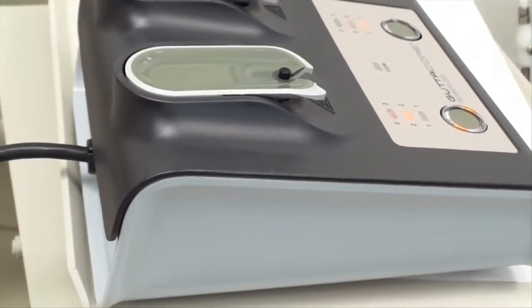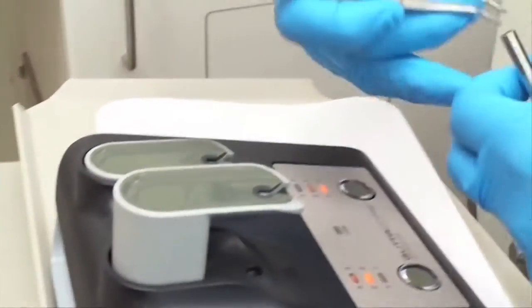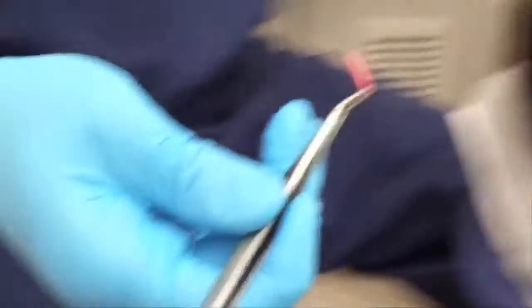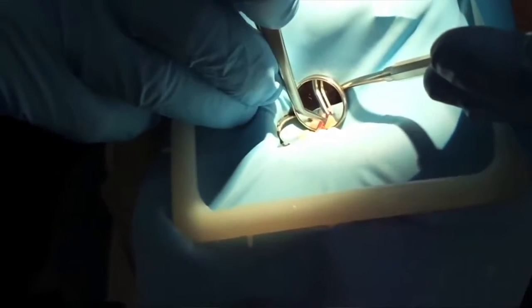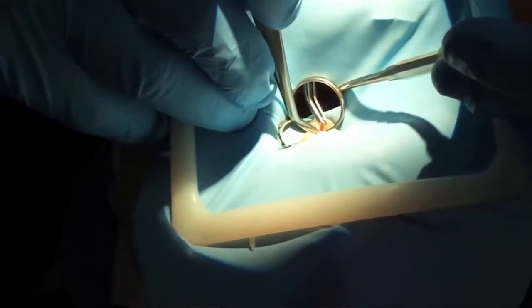Once ready to obturate, ensure the oven is set properly. Place the cold GuttaCore in the oven and wait until it blinks — this signals the GuttaCore is sufficiently warmed and ready for insertion into the canal. Remove the GuttaCore from the oven and grab it with cotton pliers at the working length as indicated by the markers on the GuttaCore. Break the GuttaCore handle above the length of the marker and place into the canal. The delivery of the warm GuttaCore from the oven to the tooth should not take too long; to maintain the intended GuttaPercha characteristics, this should be done in less than about 10 seconds or so. It may sound like very little time, but it's actually more than enough. If you spend any longer, the GuttaCore will cool down too much and this will affect the insertion flow into the canal and the final obturation.